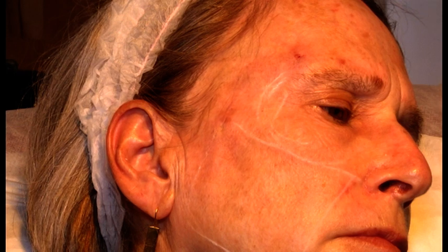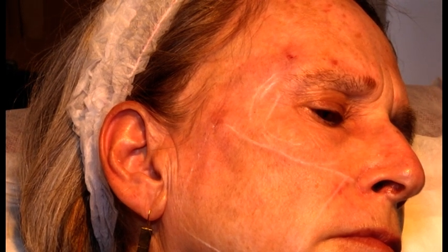Somebody had a question? All right. Needle? Or actually, you know what? I'm mark first. Mark now.